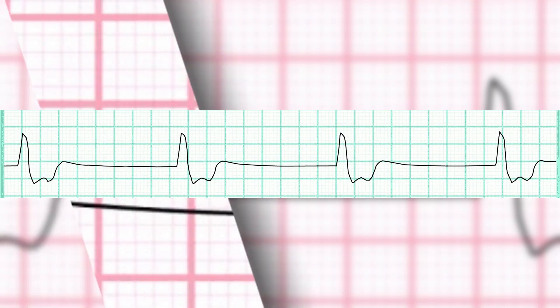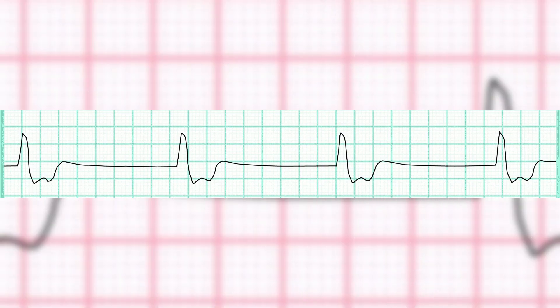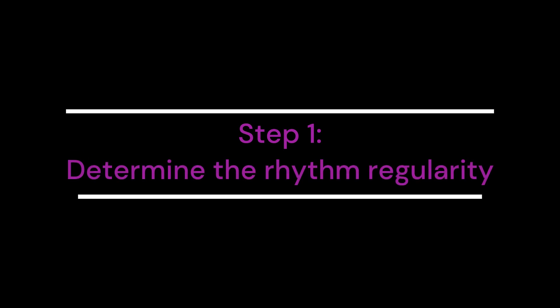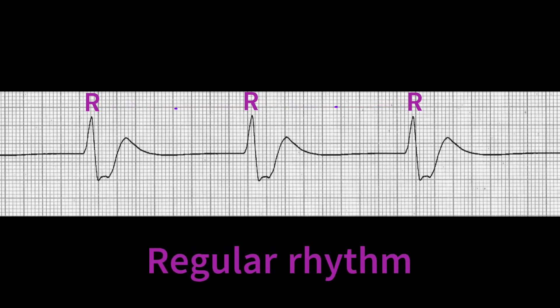Now, let's take a closer look at the EKG analysis of idioventricular rhythm. Step 1: Determine the Regularity of the Rhythm. Idioventricular rhythm exhibits a very regular rhythm — the R to R intervals are identical and consistent.